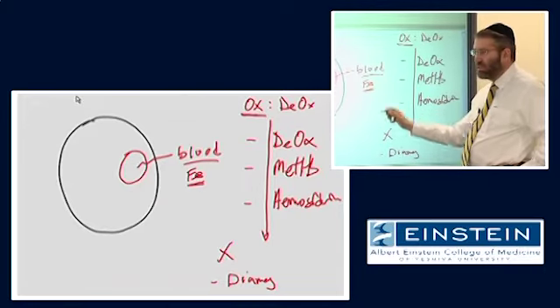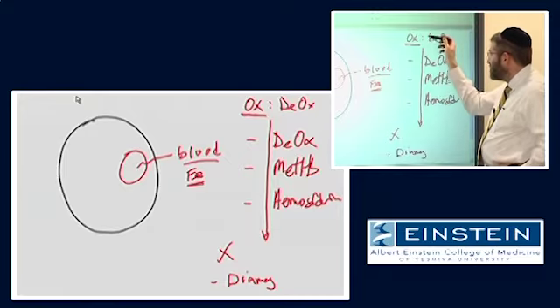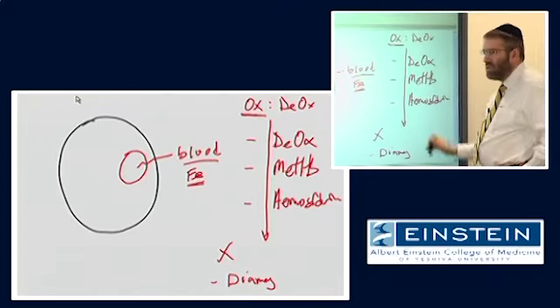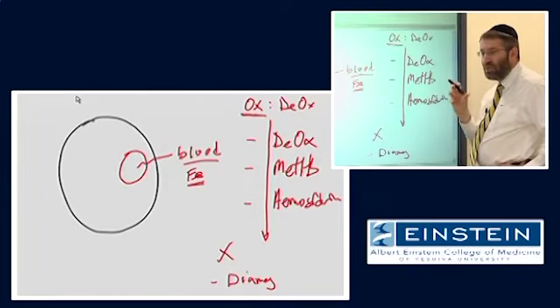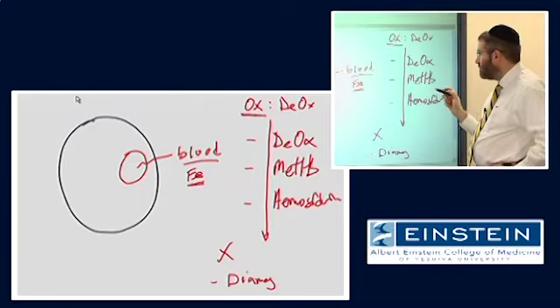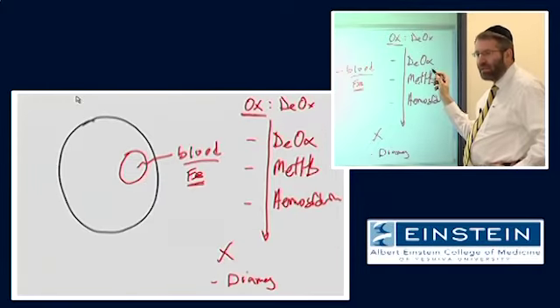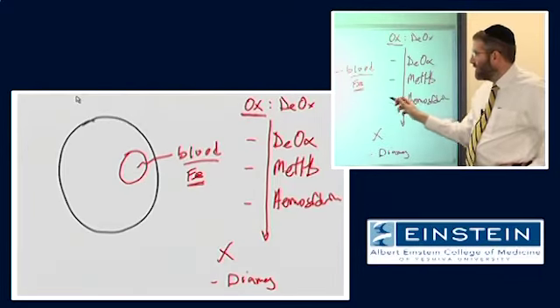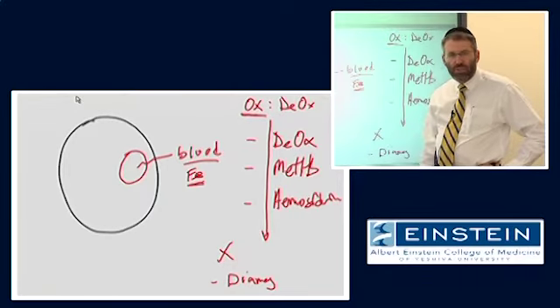Specifically, you won't expect to see that kind of signal loss. The change from oxygenated to deoxygenated hemoglobin results in a change in the conformation of the molecule, such that we now have a dramatic magnetic susceptibility effect and very large amount of signal loss.